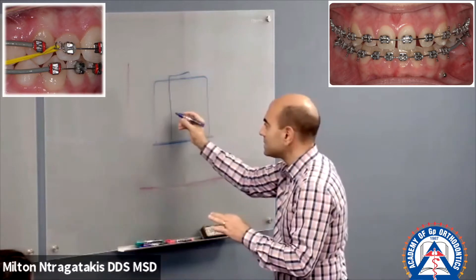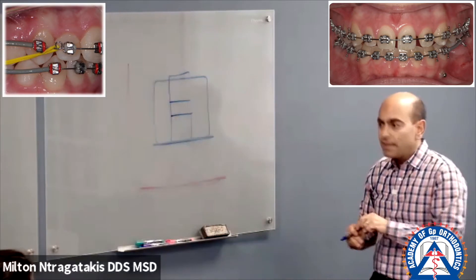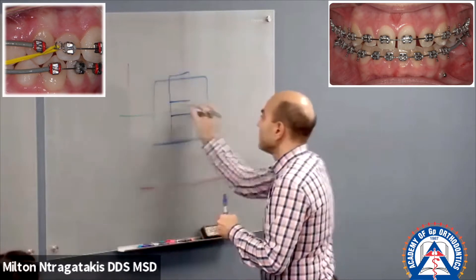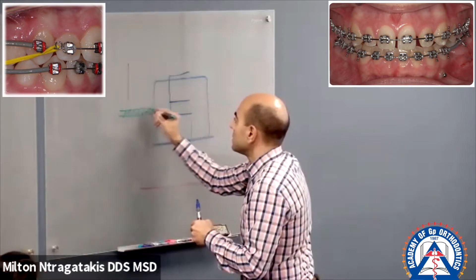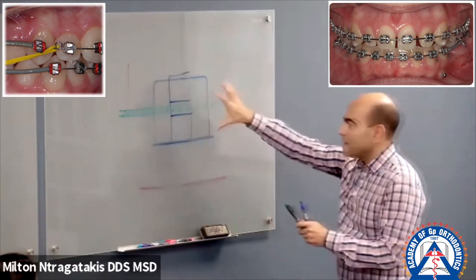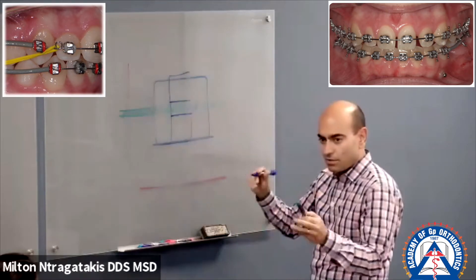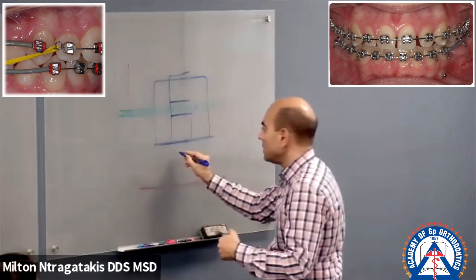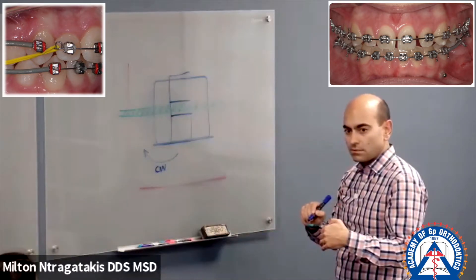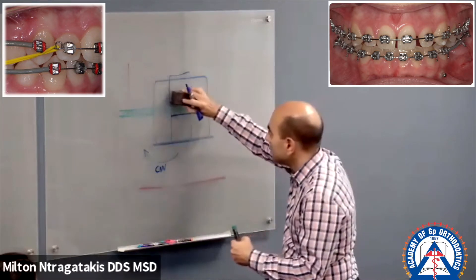Tip edge brackets don't have a straight slot. If they had a straight slot and the bracket was rotated — for example, if I rotate the bracket clockwise, because I bonded it rotated — what shape would the slot have?